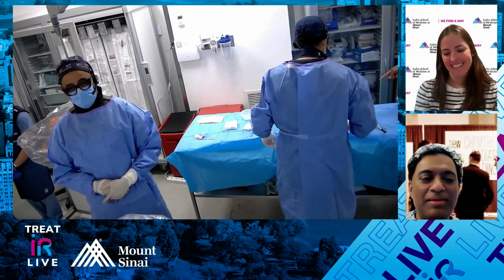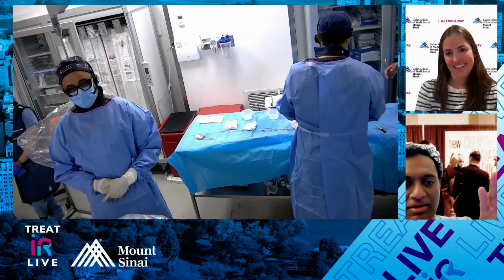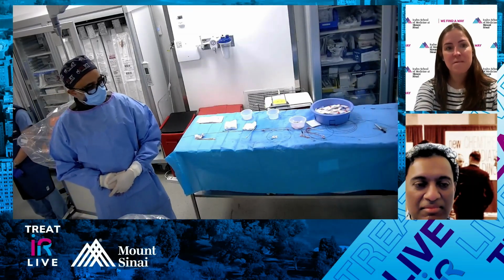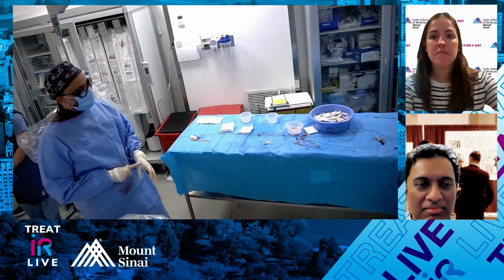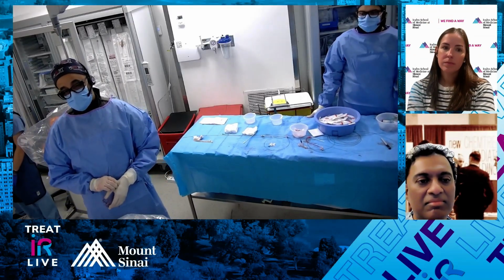Let me add one other question. I've seen people do this snuff box or distal radial access. Do you use it, and if so, when? We haven't used it a lot. We did for a short period of time try the snuff box access. People say it's more comfortable. I don't know if it's safer or anything like that.